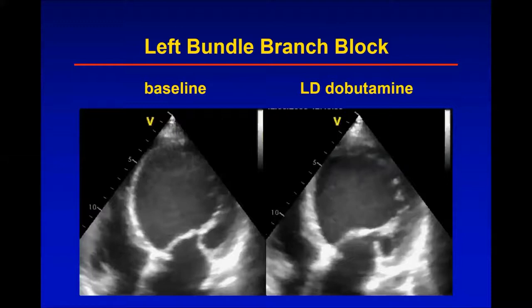We have to go local. We have to measure the local function of the myocardium. How can we do that? We do the same thing. We use this concept of the pressure volume loop, but we try to apply it locally.